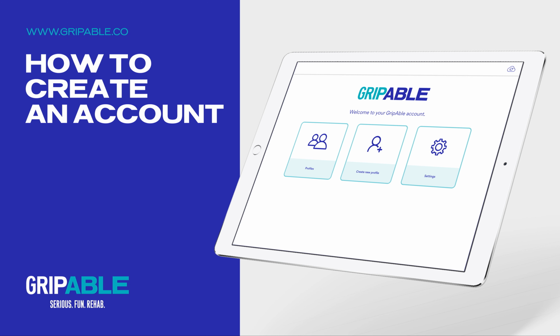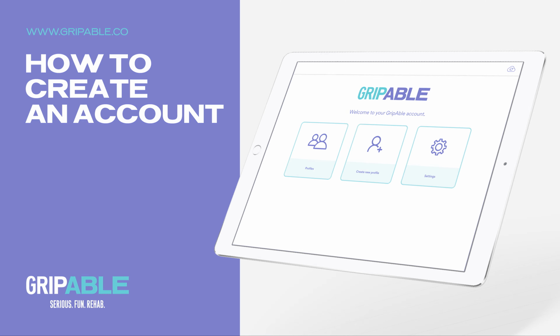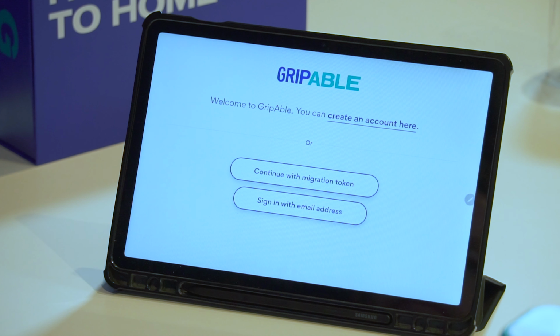How to create an account. When opening the GripAble app for the first time, you need to create an account. To begin, tap Create an Account here.